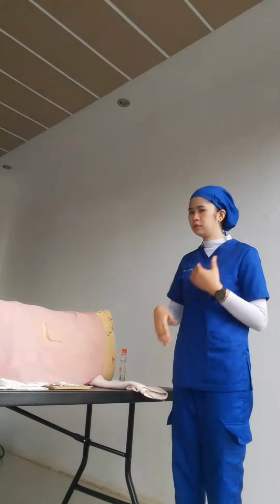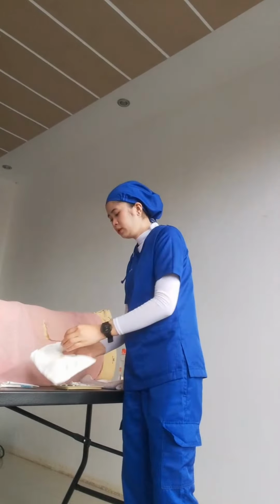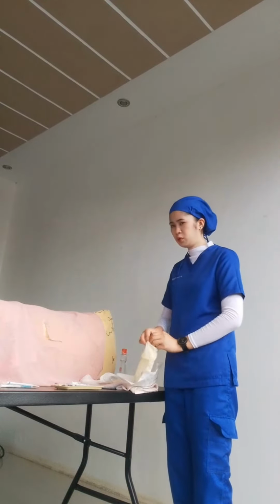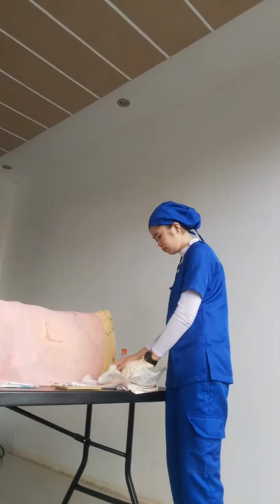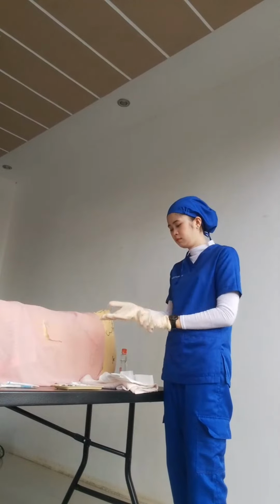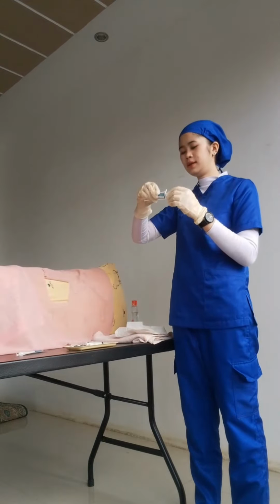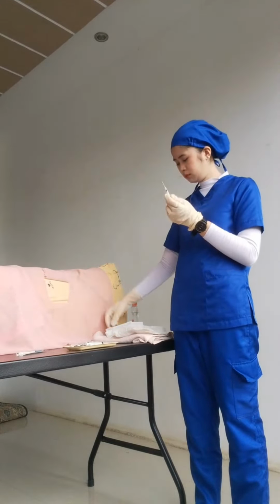So I have already discussed the procedure, and now I am going to perform the lumbar puncture. First, you have to put the gloves on. Remove the packages of the 5 cc syringe, and after removing, also remove the cap.